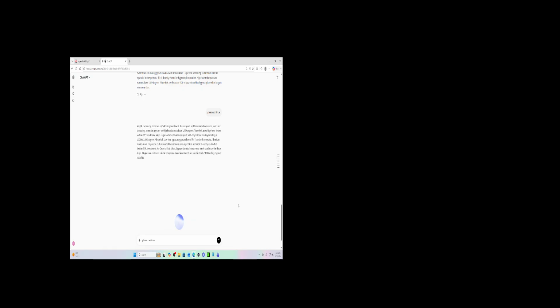2.17 Handling gypsum materials. Rule 1: Keep everything clean. Rule 2: Tumble contents before using. Rule 3: Add powder to water, not water to powder. Rule 4: Always measure water and weigh powder accurately. Rule 5: Mix well but don't whip air into the mix. For phosphate bonded investments, vacuum mix to remove gas from the mass. Rule 6: Never add to a mix. Rule 7: Use good equipment that is clean and accurate. Rule 8: Avoid contamination. Rule 9: Know your material, including batch number and expiration date.